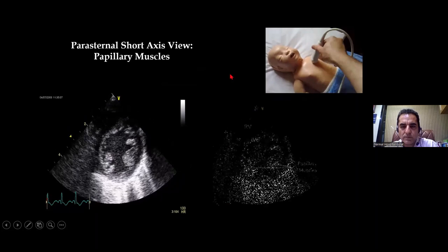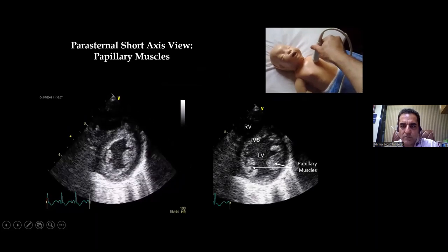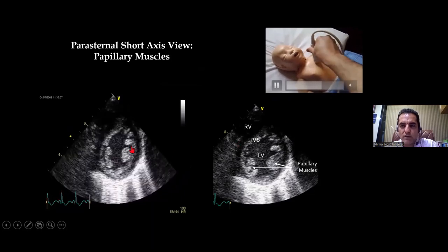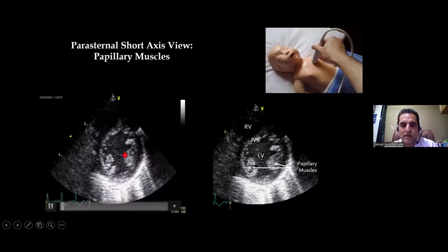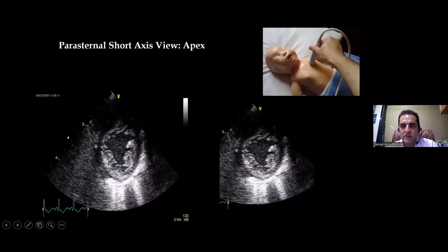Sweeping further down from the mitral valve towards the apex, the next structure you will see is the papillary muscles — this is the papillary muscle view.